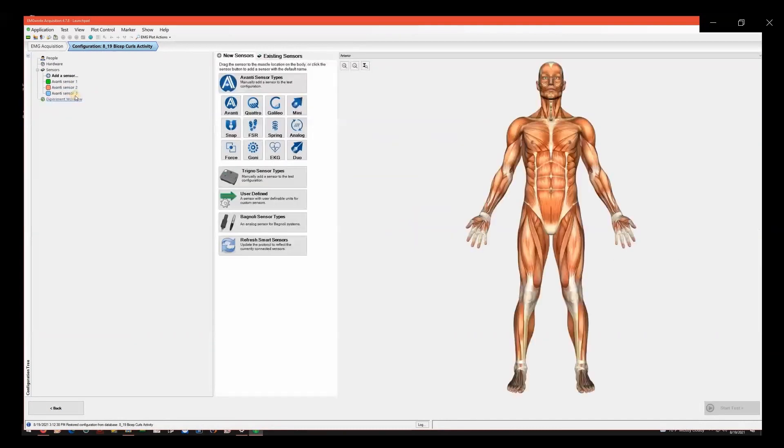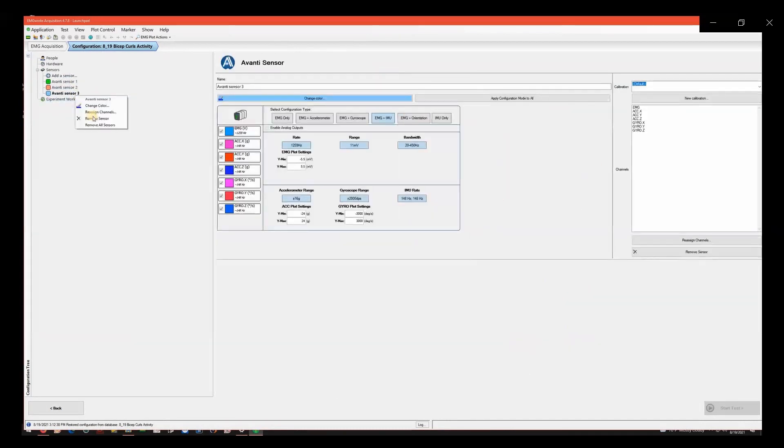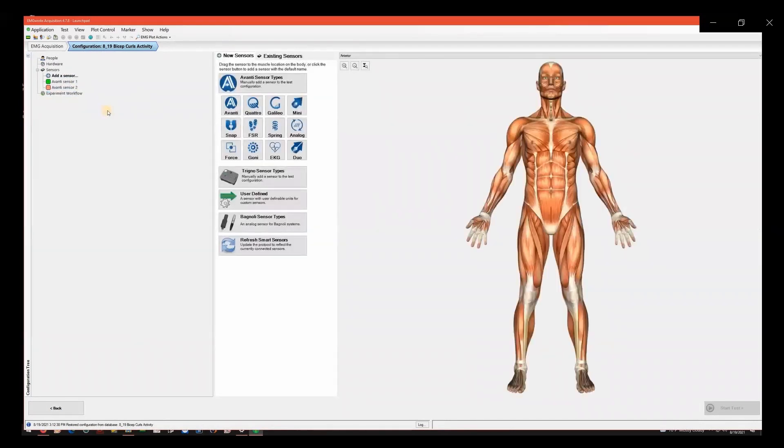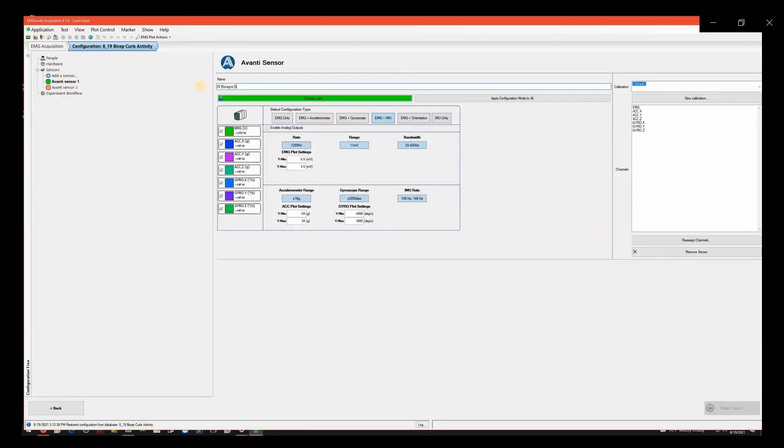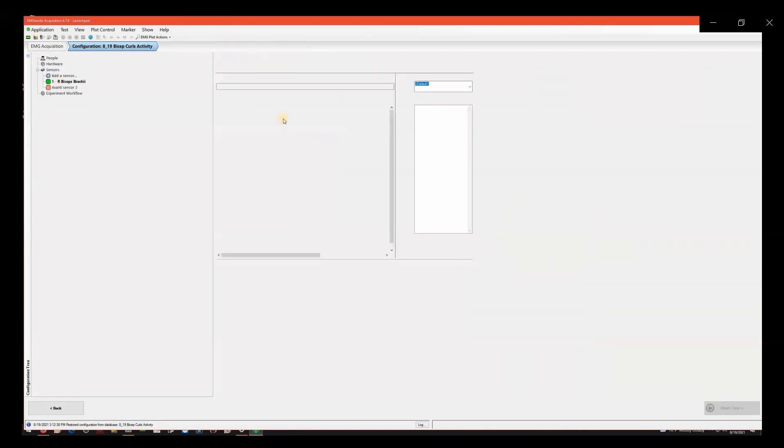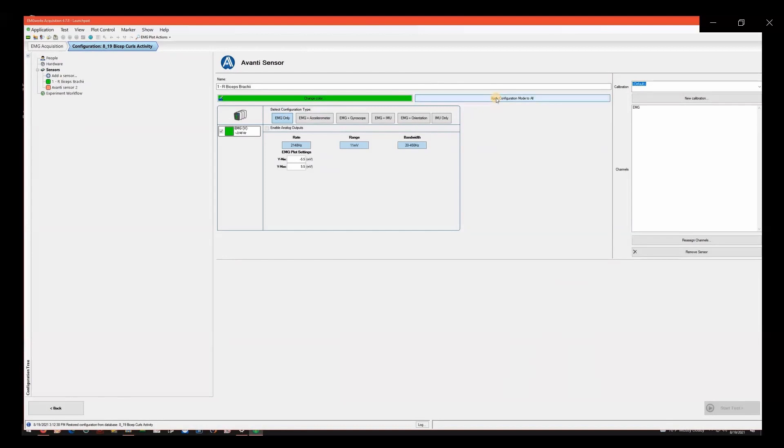Left-click on Avanti Sensor 1 to bring up the options menu for the sensor. Rename the sensor based on the location you will be placing it. Be sure to still include the number of sensors in the name to help keep track of which sensor you will be placing on what muscle. Example: 1. Right Biceps Brachii. If you do not need the accelerometer or IMU data, it is recommended to set the configuration type to EMG only. This increases the rate or frequency of data collection which results in higher quality data. Click on EMG only and then apply configuration mode to all.